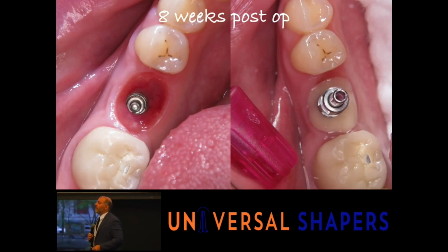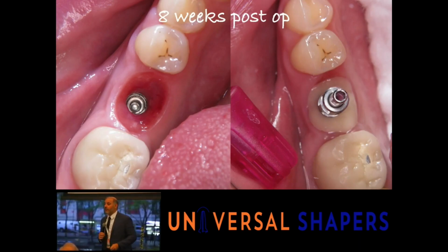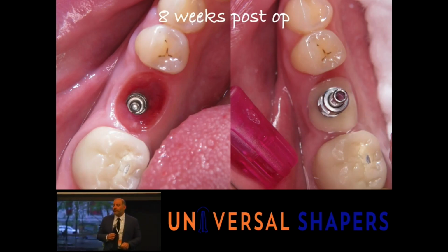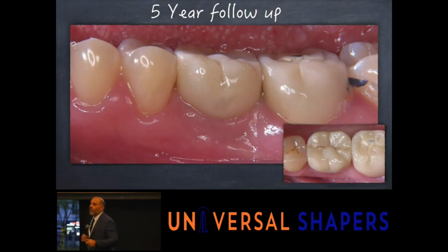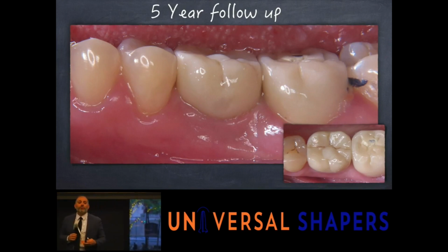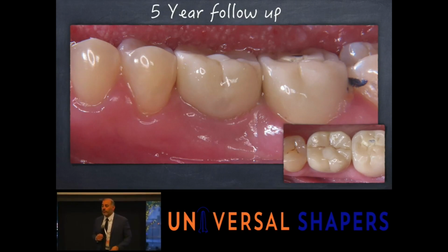Do I find a limitation in terms of depth? I think depending on the scanner. There's several different scanners. I can have a conversation with you. I don't want to make this all about intraoral scanning, but there are scanners that are better than others, certainly in terms of depth. But when we look at this 5 years later, it looks like we have a natural tooth there. It doesn't look like we have a false tooth there. And that's what we want to try to do. Our patients are not coming to us for implants. They're coming to us for teeth. So we want to try to recreate what they had as best as we can. And to do that, sometimes we have to implement little tricks like that for capturing soft tissue.